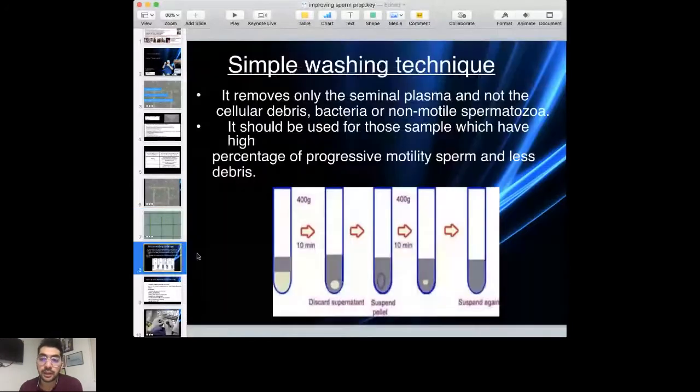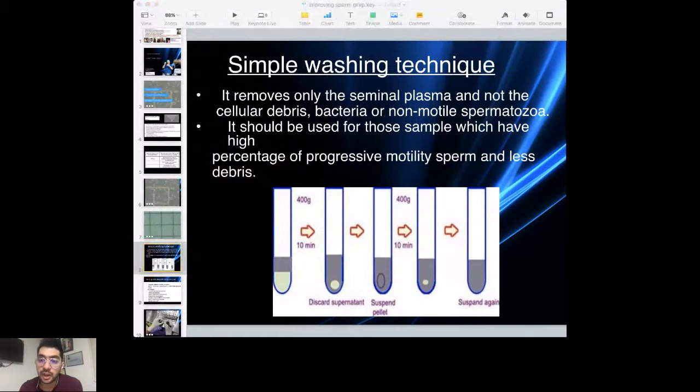And I'm going to show you a few videos as well. So if you don't understand anything here, or if you want me to repeat a step, please type the question in the chat bar, and I'll try and answer that. So the first technique that we use is simple washing.